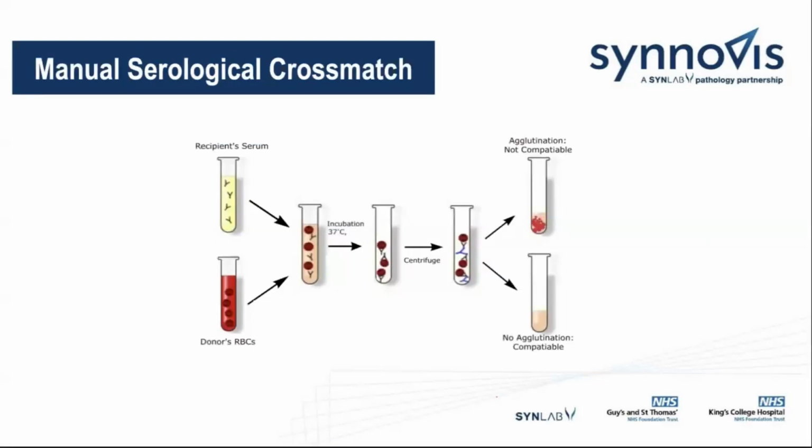So we've got our manual serological cross-match, which I previously mentioned, and we do this by IAT testing. Traditionally, this is the final step in providing safe blood by performing a serological cross-match between the patient's plasma and a sample of red cells from the donor units. It's performed at 37 degrees, and we're looking for evidence of a reaction which may indicate incompatibility. So the IAT test is used to detect ABO and non-ABO red cell incompatibility between the donor red cells and the plasma.